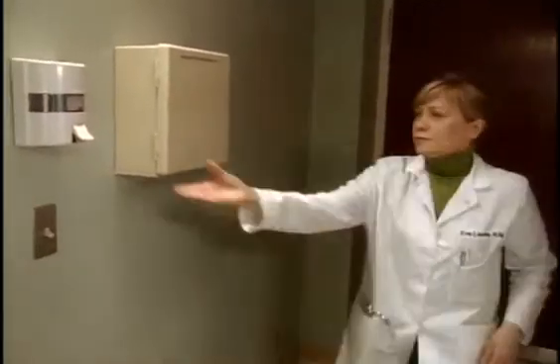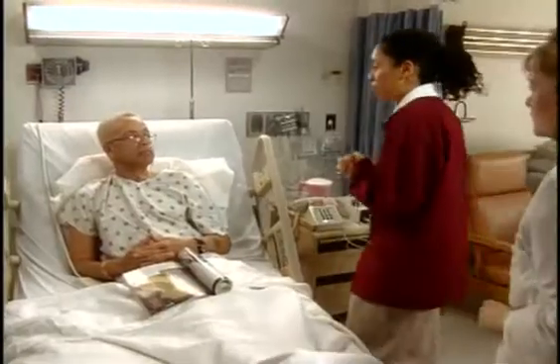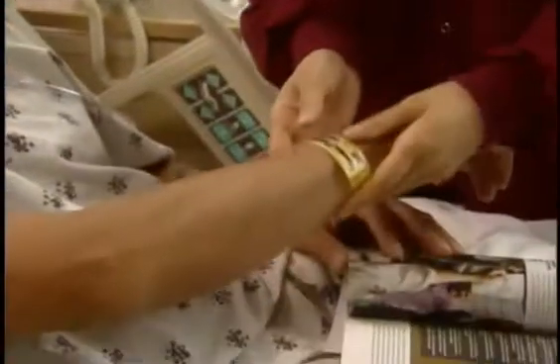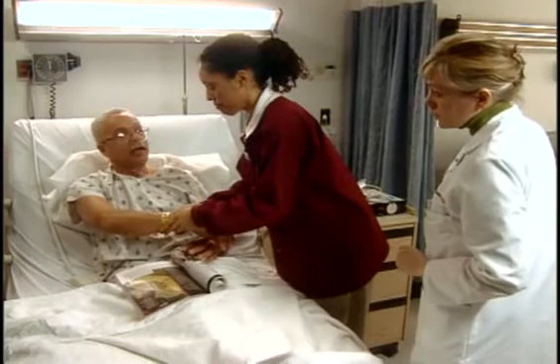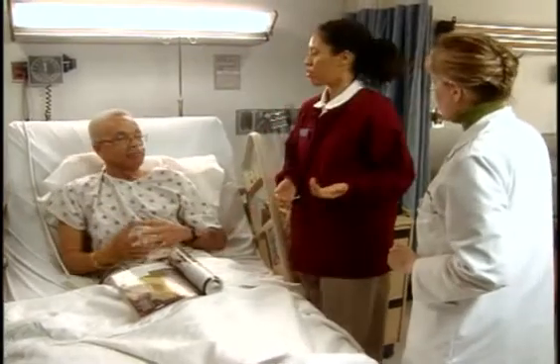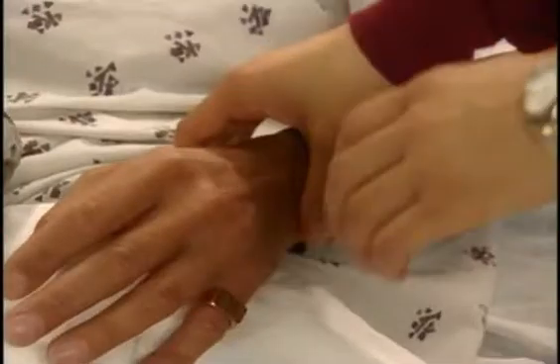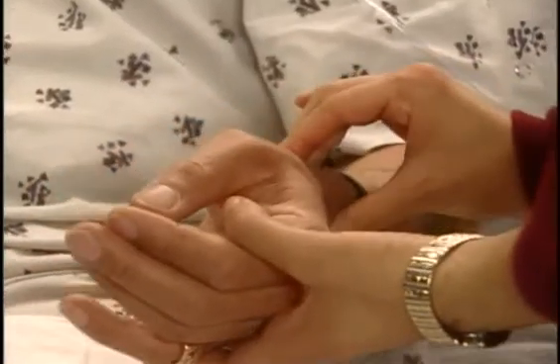Hey, Mr. Howard. So I'd like to check your oxygen level, make sure you're getting the right amount. Is that okay? If it'll help, sure. Okay. Let me see your ID bracelet. Can you say your name? Marvin Howard. Great. This is my instructor, Miss Lewis, and she's going to be observing us today. Is that okay? That's fine. The more opinions, the better, right? Right. So I'm going to be using your index finger for this. So now I'll assess the pulse closest to the site and capillary refill.